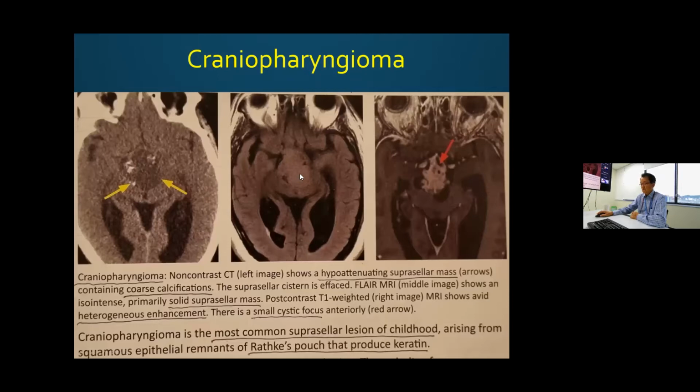the pituitary, that's called craniopharyngioma, which is common in young children, young people. Right here, a pediatric case, a mass right above. So it's a good location that makes some differential diagnosis. You have to describe very precisely the location anatomically, based on CT or MRI, and then characterize the abnormality based on the shape, location, etc.